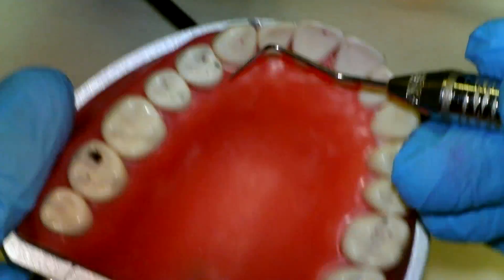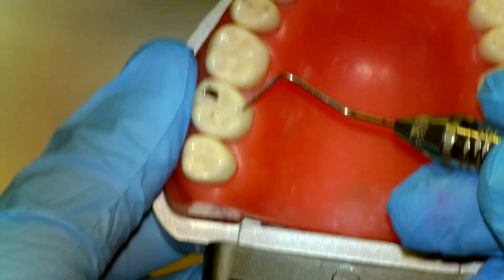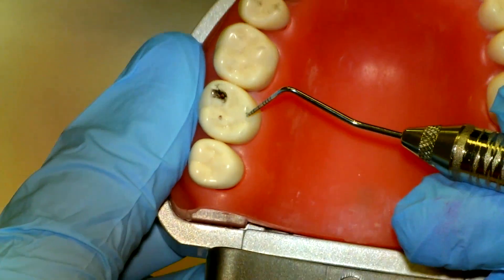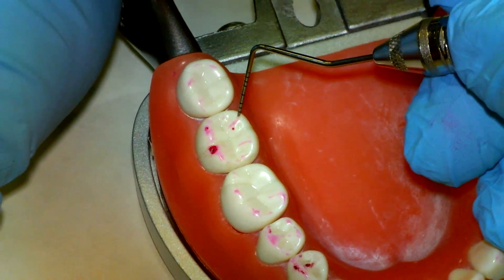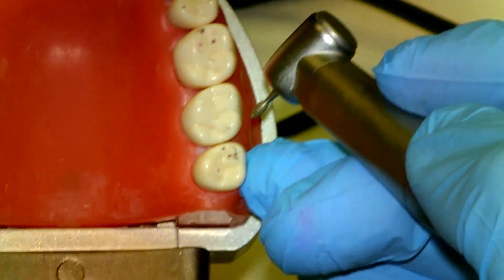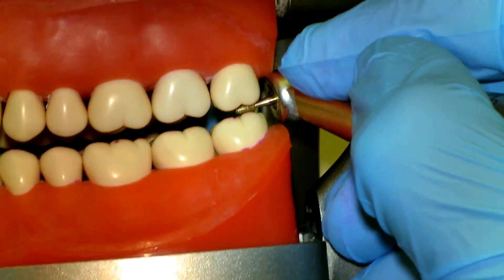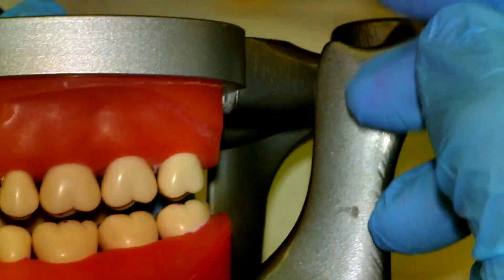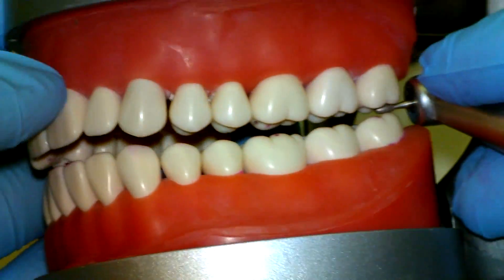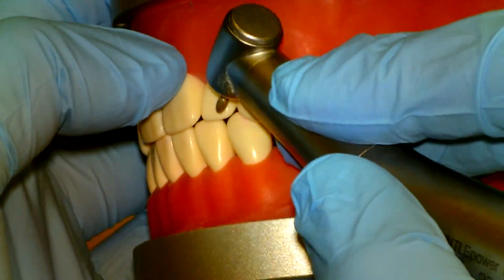We have three points on this premolar that correspond with three marks on the molar. Going through the criteria, we see contacts on non-functional areas, so we're going to grind those — we'll leave the functional cusp alone. Remember, the closer you are to the posterior, the less you'll probably need to adjust. Since this is on a hinge, if you're open a little bit in the back, you'll be much wider in the front. A small adjustment in the posterior goes a long way in getting the anterior to close down.